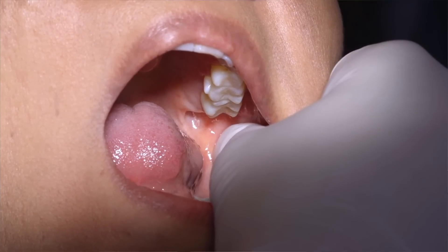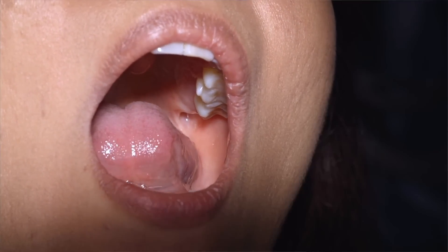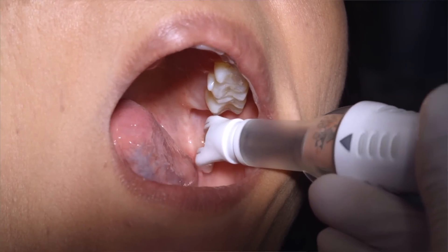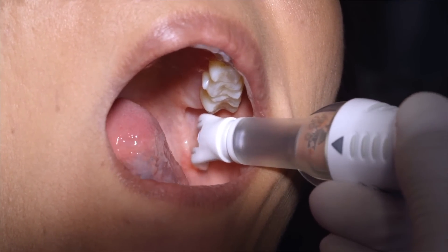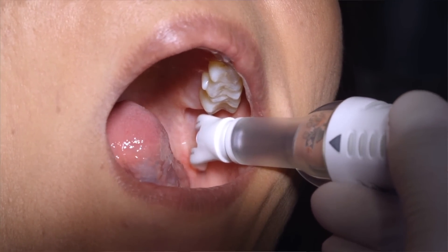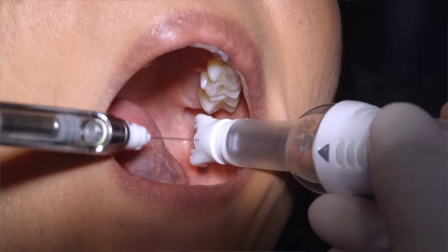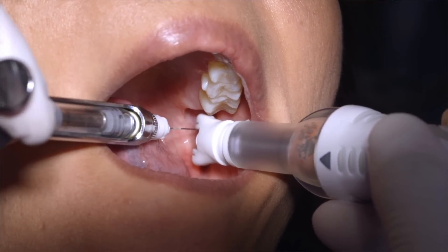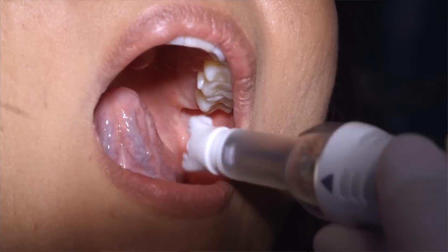Place the Dental Vibe at the targeted site of injection. Vibrate the tissue, then push a little deeper to vibrate the mandible and insert the needle as close to the prong as possible. Aspirate and slowly deliver the injection. After the injection is done, remove the needle and the Dental Vibe.